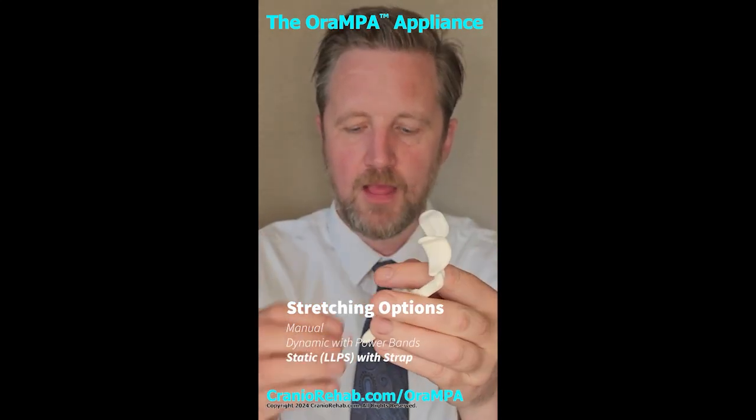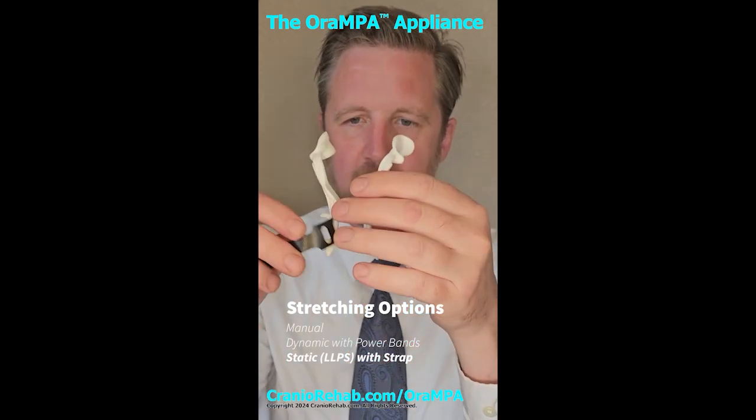The last way to stretch is doing a static stretch, and for that we use our strap here.